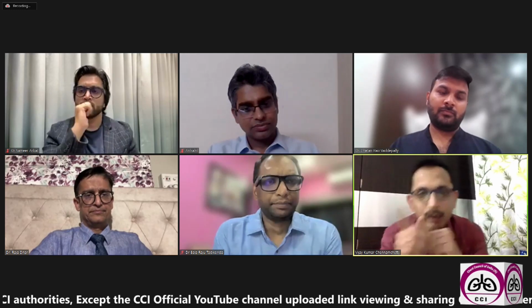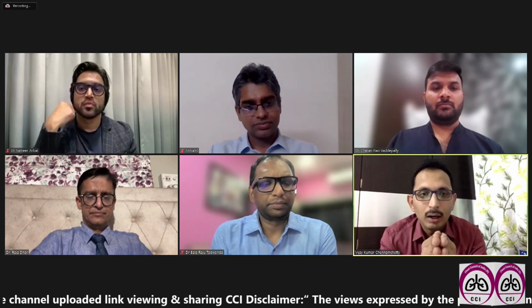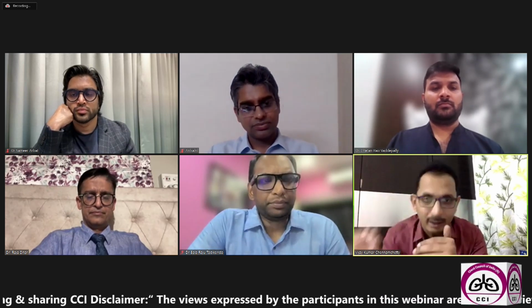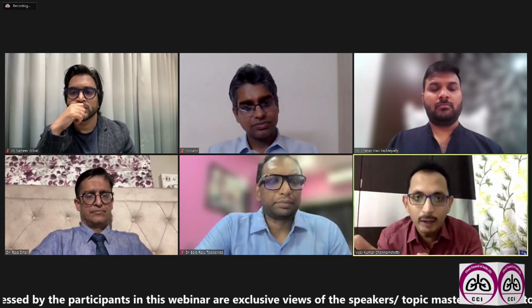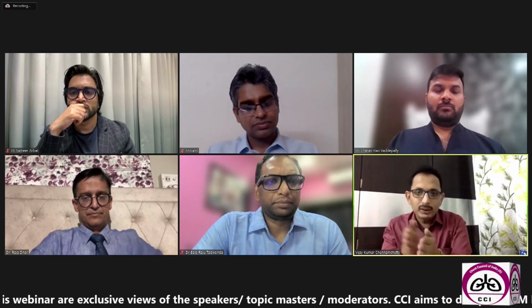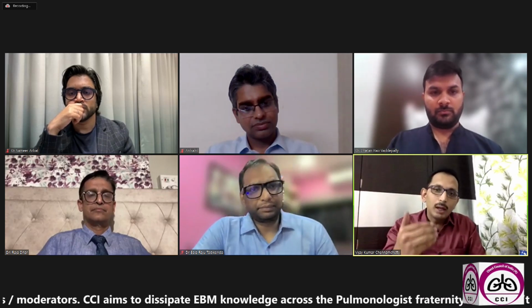And coming to Bala's point, I totally agree with Bala, and Samir as well. It is very important to be comfortable with whatever procedure you are planning and executing. You should begin from the end. In the sense, what if flexible bronchoscopy doesn't work, you should have a backup of rigid. And if you cannot place a blocker or Fogarty balloon besides the endotracheal tube, you should have an LMA in position. You should have a rigid in position. So it's not about one particular technique. We should master everything to become a perfect interventional pulmonologist and to become an expert in cryo particularly.